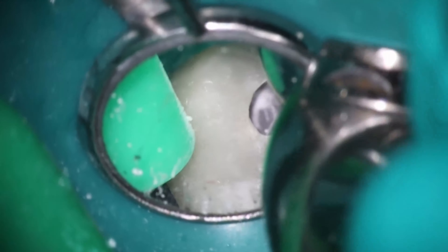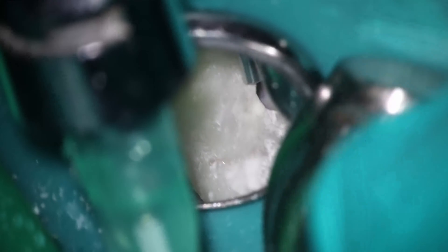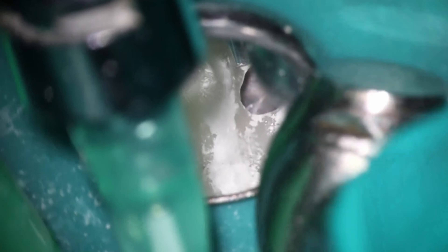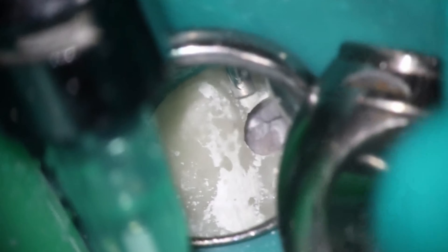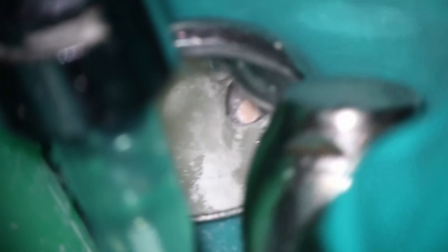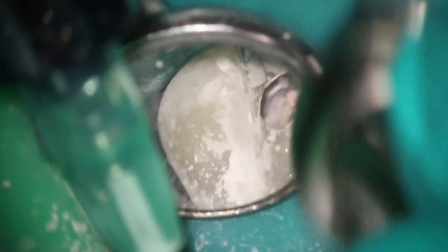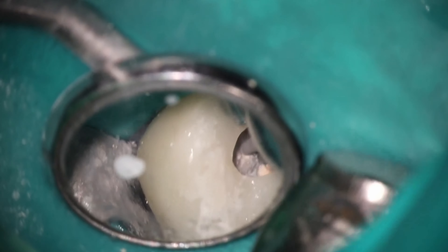Once we're down about three, four, maybe five millimeters, I'm going to switch over to the workhorse. I use it without any water because composite makes such a different color dust than dentin does. This allows me to be very conservative in how much I remove, because I only want to remove the existing composite — I don't really want to remove any tooth structure at all once I have to go after MB2 or something like that. You'll see I'm hitting the gutta percha a little bit — that's totally fine.